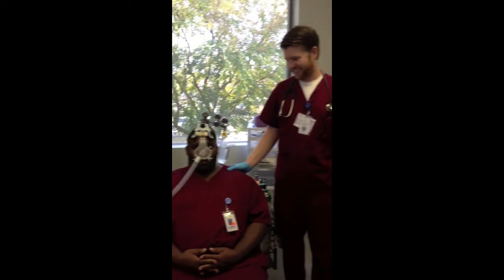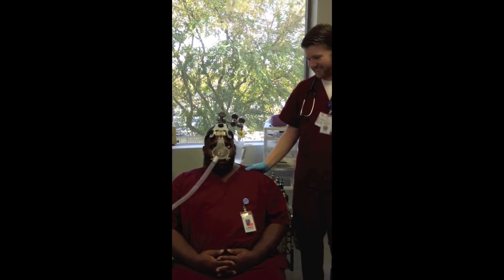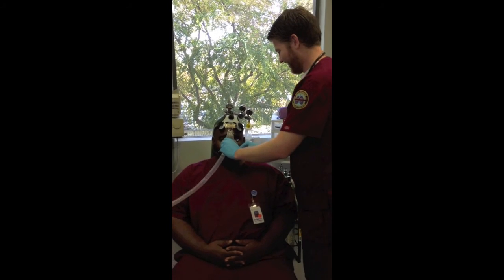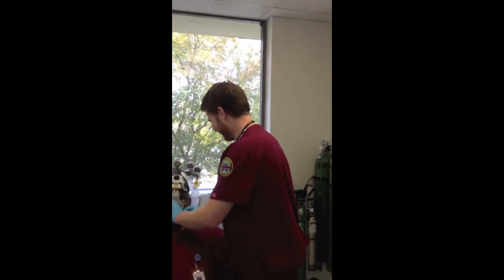Now remove any unnecessary equipment. Record all data collected before and after initiation of CPAP and BiPAP.